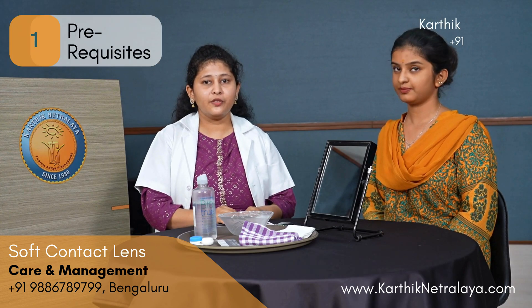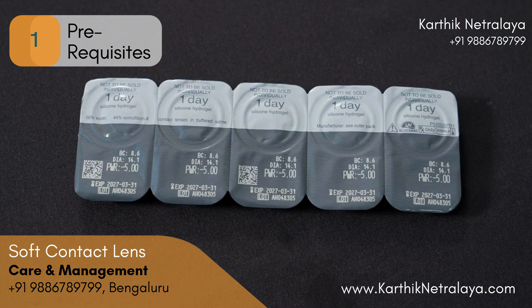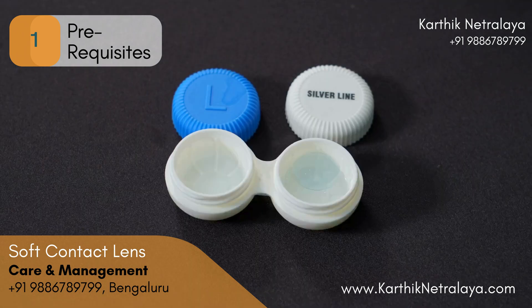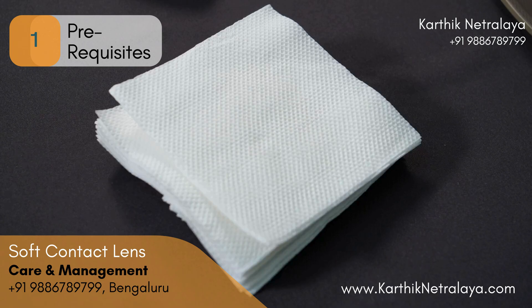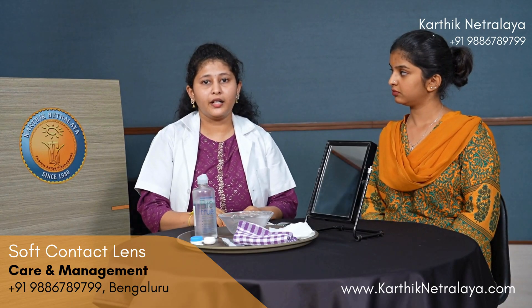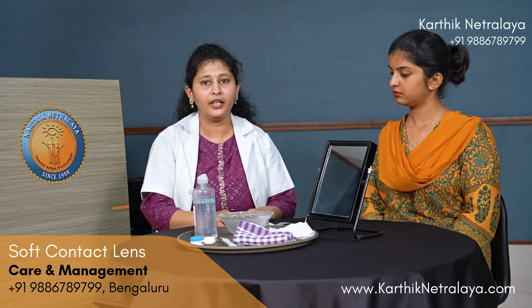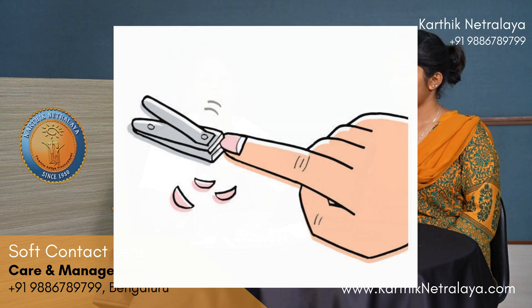The pre-requisites for soft contact lenses are: contact lens solution, contact lenses, contact lens case, cotton, a washed cloth, some tissues, and a stand mirror. Before you wear contact lenses, make sure the place is hygienic and neat, wash your hands with soap, rinse thoroughly with water, and make sure your nails are trimmed.